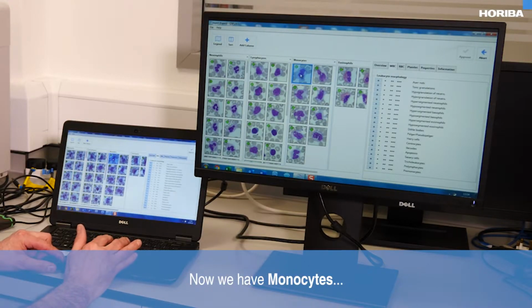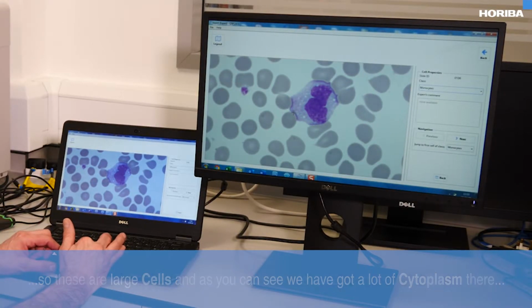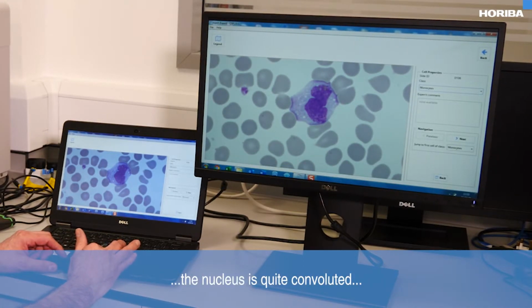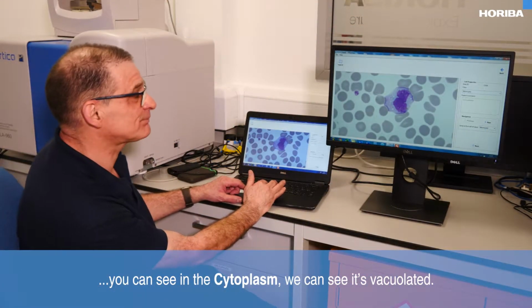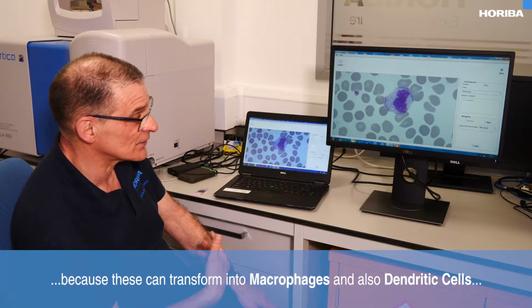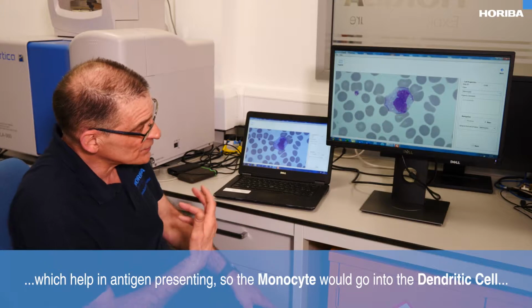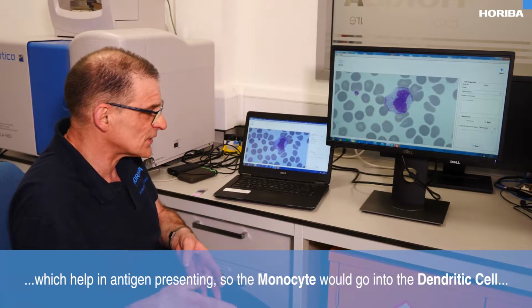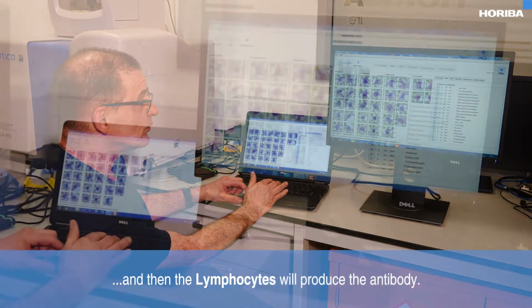Now we have monocytes. So these are large cells, and as you can see, we've got a lot of cytoplasm there, and this colour of the cytoplasm is often called a ground glass appearance. The nucleus is quite convoluted. You can see in the cytoplasm, it's vacuolated. Quite large cells. Monocytes are very interesting in fact, because these can transform into macrophages and also dendritic cells, which help in antigen presenting. So the monocyte will go into the dendritic cell, which then processes the antigen so we can produce an antibody, and then the lymphocytes will produce the antibody.